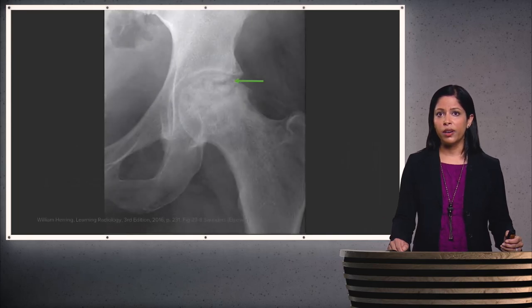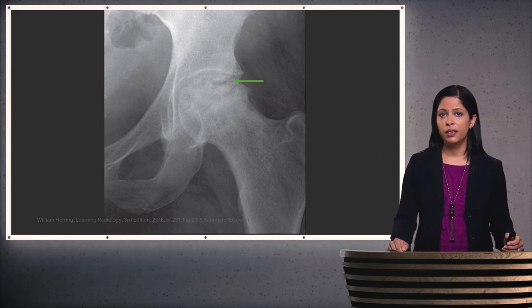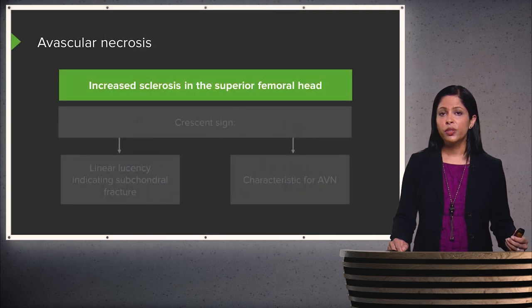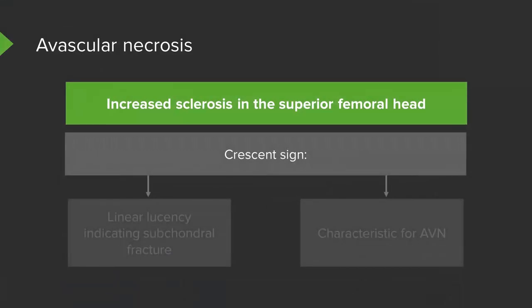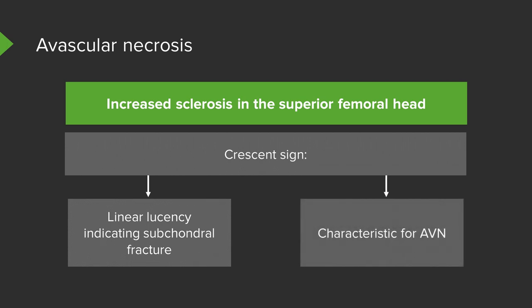This radiograph shows another example of the left femoral head with an arrow pointing to the abnormalities. There is increased sclerosis in the superior aspect of the femoral head. There is also what we call the crescent sign, which is a linear lucency indicating a subchondral fracture. This is also a very common sign seen in avascular necrosis.